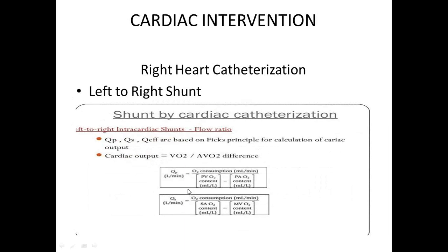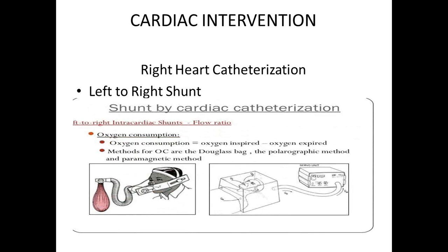And then the arteriovenous oxygen difference, if you're talking about the pulmonary circuit, is the pulmonary venous oxygen content minus your pulmonary arterial oxygen content. And then for the systemic, it is your oxygen consumption again over your arterial, which we usually use the aorta, minus the mixed venous O2 content, which is the pulmonary artery. Okay. Once you use this a few times, you'll be familiar with it.